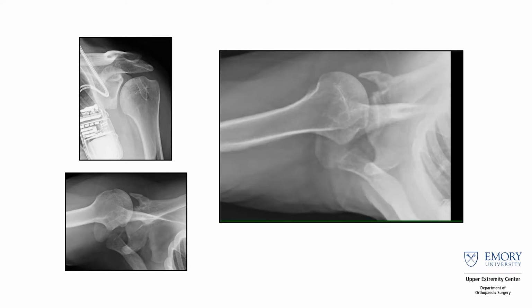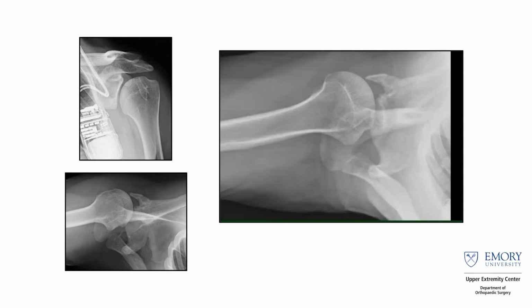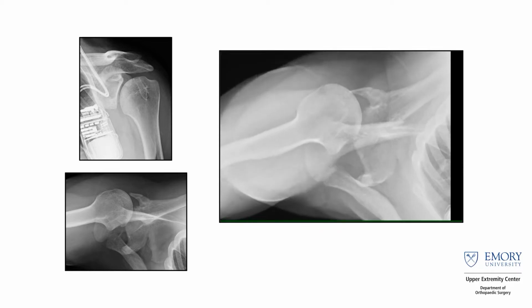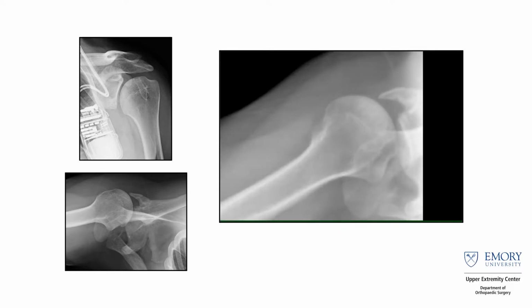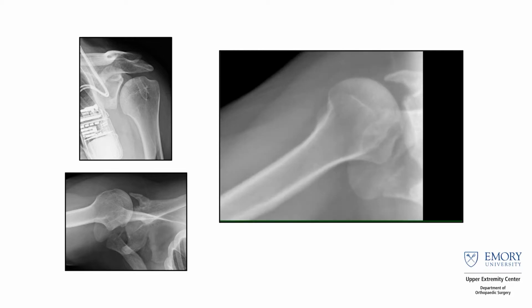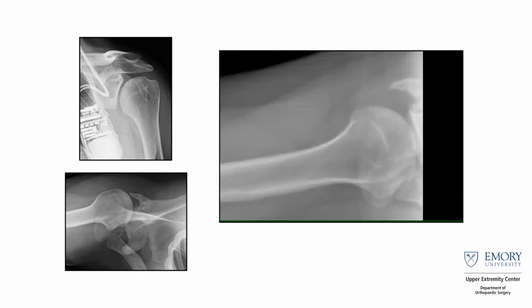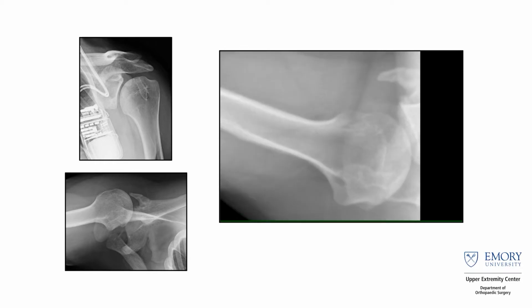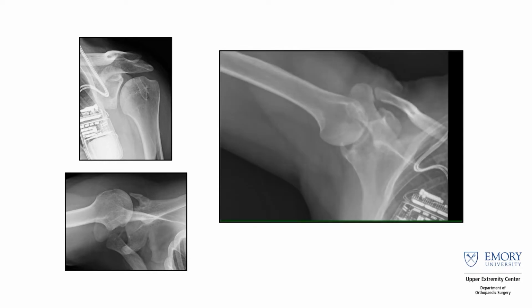But I think when you see the DDR, you can really get an understanding of what's going on. So you can legitimately see his shoulder sublux from in the glenohumeral joint and then out posteriorly back into the glenohumeral joint and back out posteriorly where that bony Bankart is. So you can see on these multiple views how his joint is legitimately subluxing from inside the glenohumeral joint out posteriorly to where that prior bony Bankart was from, probably one of his 100 plus dislocations.